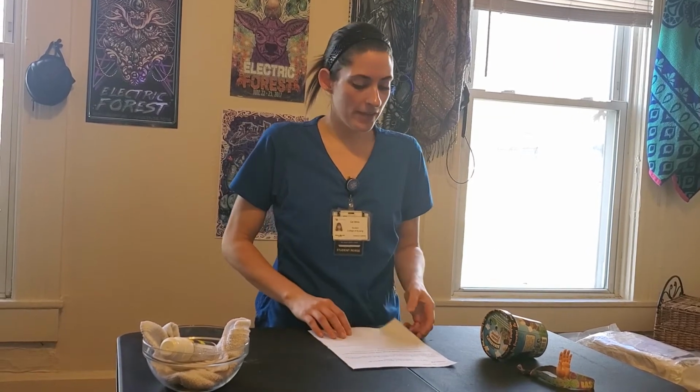My name is Kat White with UK College of Nursing for class Nursing 211, section 003. I'm going to do my Foley catheter competency today. I have scenario number 78.